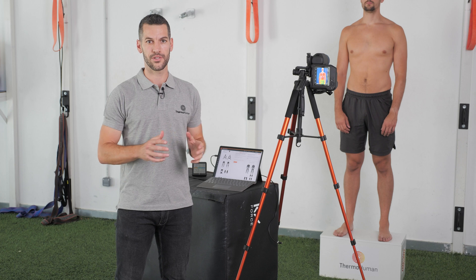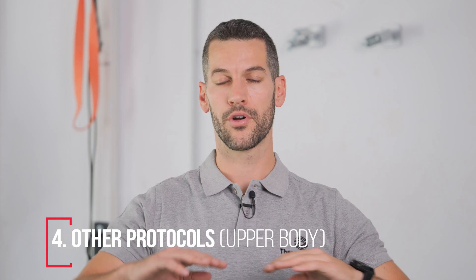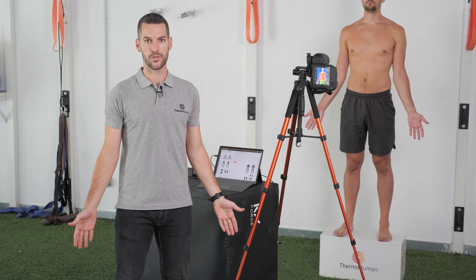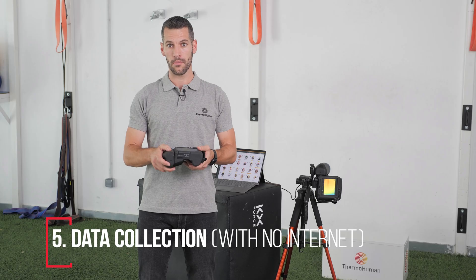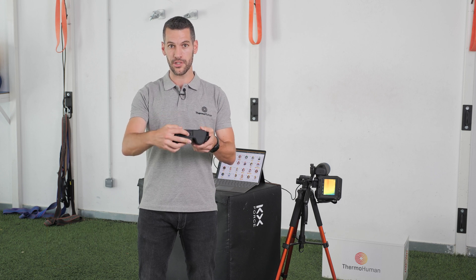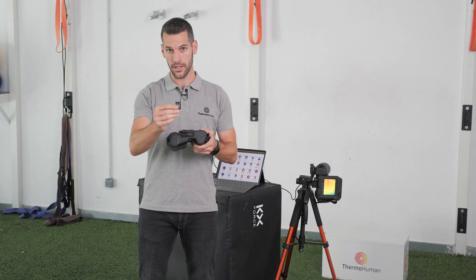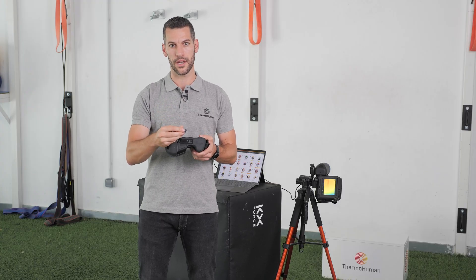If you need to take images of the upper body, remember to position the tripod and camera at approximately chest level, and the subject should be in an anatomical position with both arms not touching the body. Regarding data collection without internet connection, remember that you can take pictures and save images to the SD card, and then upload them into the ThermoHuman software when you have internet connection.